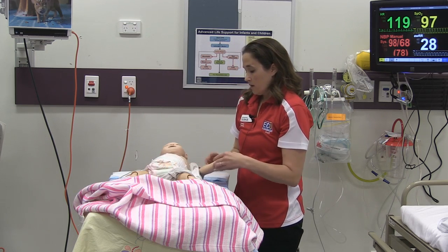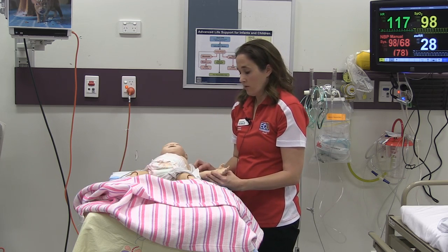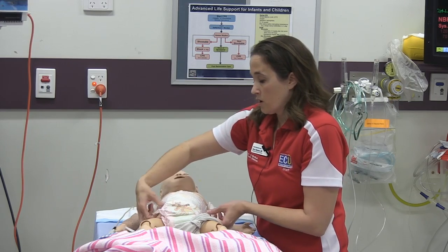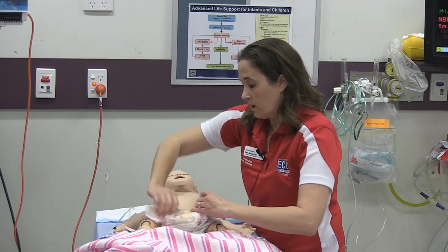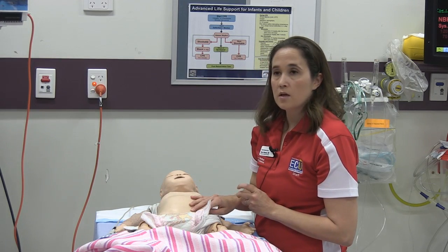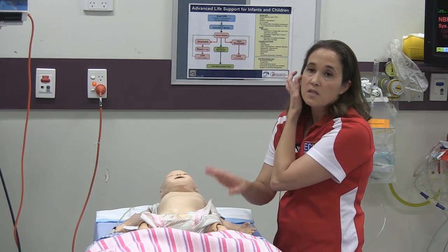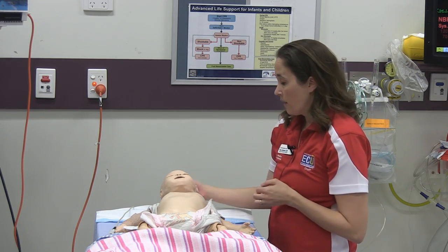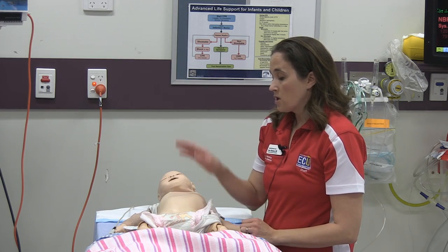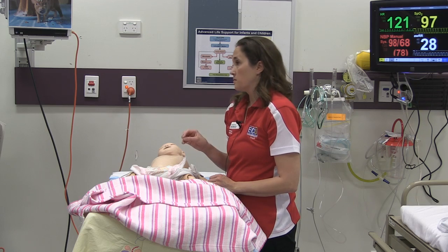The other side, so this would be the IV arm, and this would be for pulses, so you can feel a brachial pulse on this Manikin. The other area to feel for a pulse, which I was getting ready to show you, was the femoral pulses. And these are quite strong in this Manikin, so I would suggest orienting your participants to feel for the femoral pulses as well. You can make the stomach distended. You can also do bowel sounds as well.